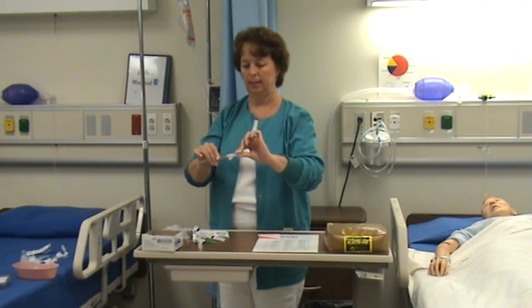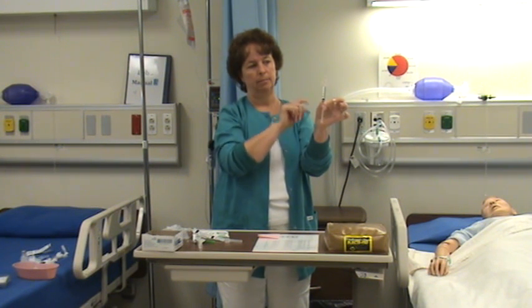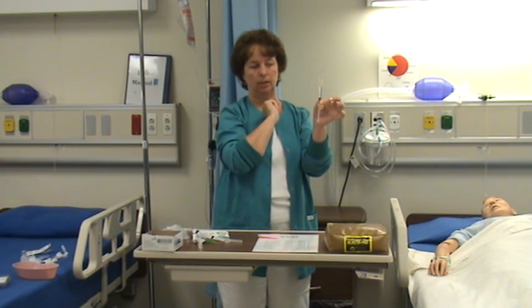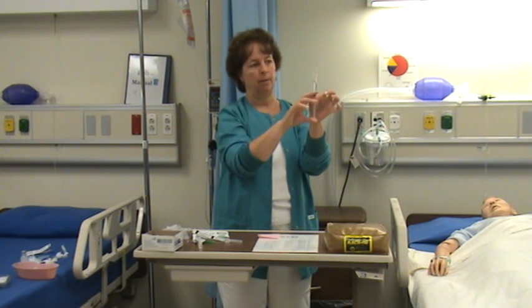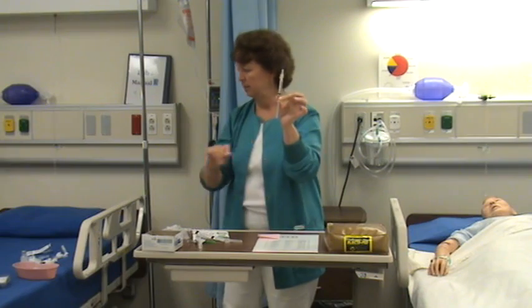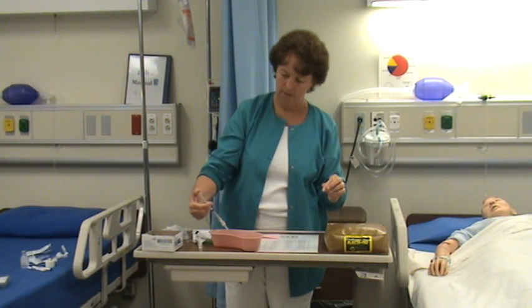Remove the cap. Now I want to get to the dose I need to administer to the patient. There's a little bit of air in the bottom of the syringe near the plunger — that happens often. You can flick your finger or tap your hand and the air will pop to the top. So with the syringe facing up, I want to get all the air out so I just have fluid. Now I have about two and a half milliliters and I only need 0.8 milliliters, so I'm going to use an emesis basin and inject the excess fluid out until I have 0.8 milliliters.